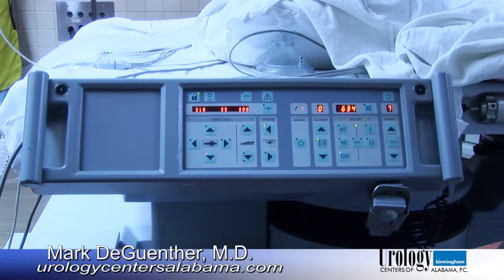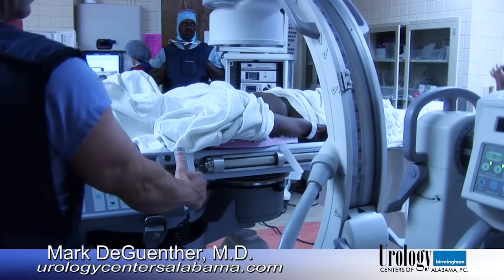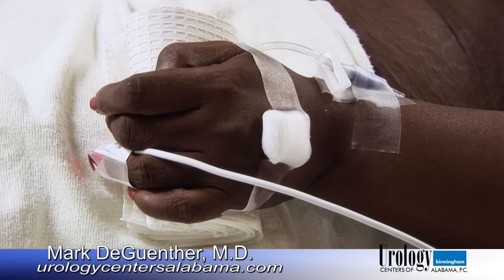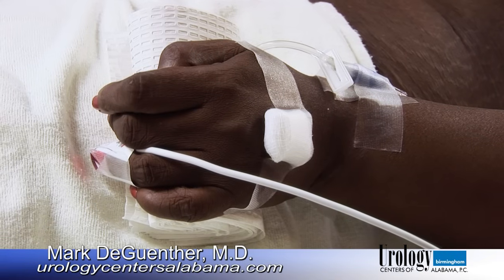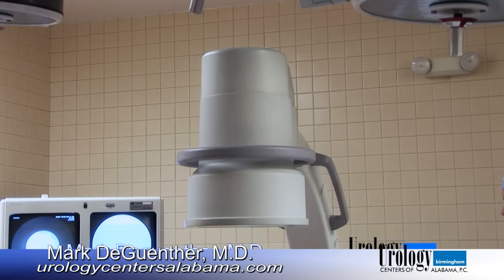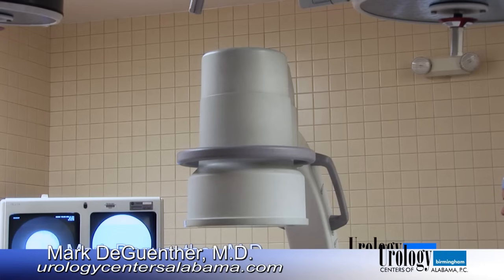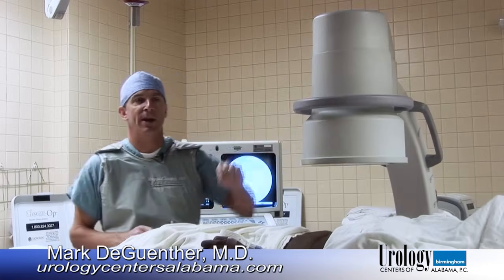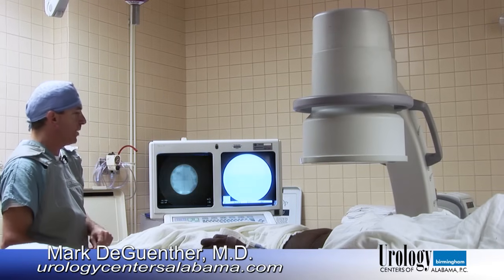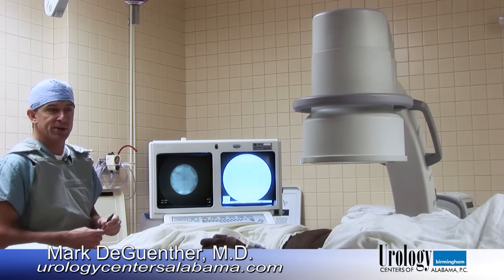These will be generated at about 120 a minute — that's the popping that you can hear right now. This is painful for patients if they are awake, so they do need some form of anesthetic. Generally, we use a spinal anesthetic, which this patient has chosen. This piece of equipment is the fluoroscopy unit, which generates the x-rays and transfers the image to the screen where we can monitor it throughout the procedure.